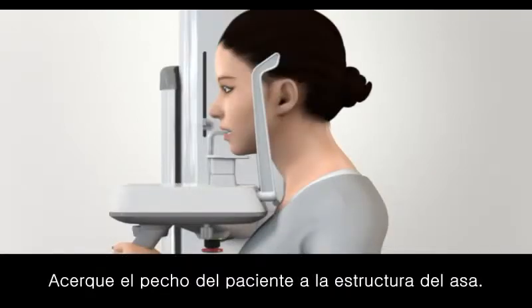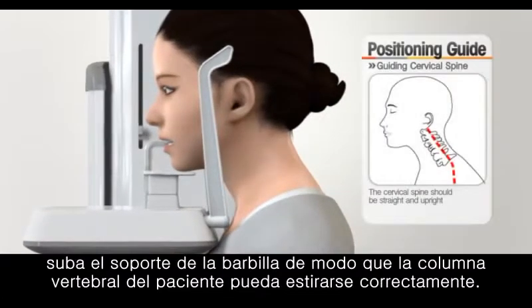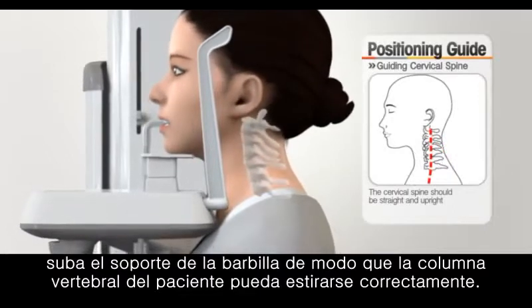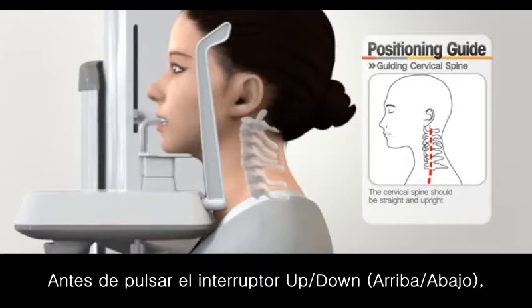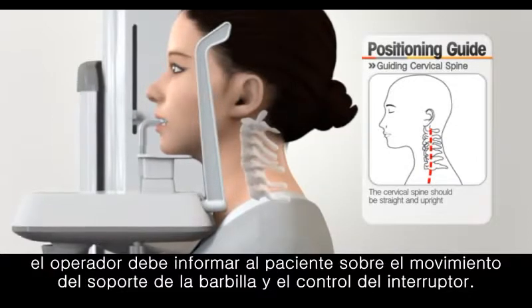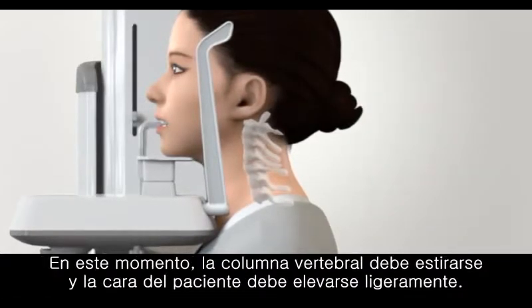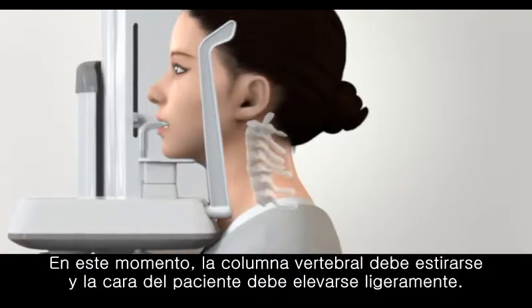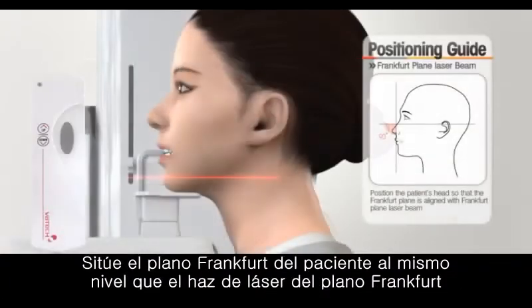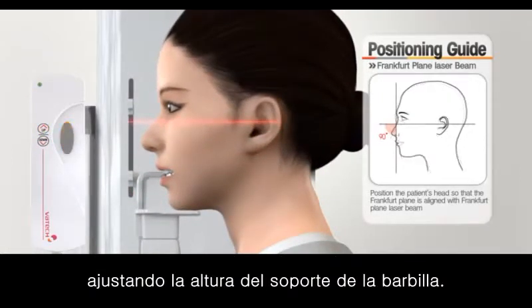Bring the patient's chest close to the handle frame. Using the up-down switch, raise the chin support so that the patient's spine can be properly stretched. Before pressing the up-down switch, the operator should inform the patient about the movement of the chin rest and control the switch. At this time, the patient should be stretched up and the patient's face is raised slightly.